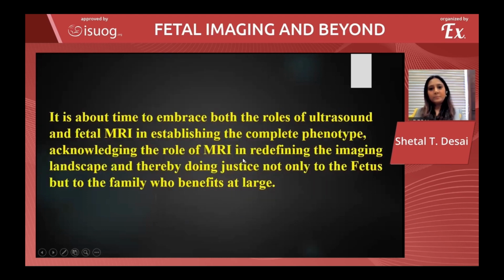So to end, it is about time that we embrace the roles of both ultrasound and MRI in characterizing the lesions and thereby redefining the imaging landscape, doing justice not only to the fetus but to the family who benefits at large.